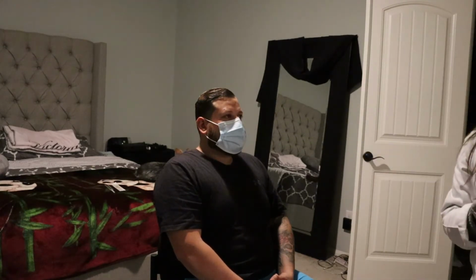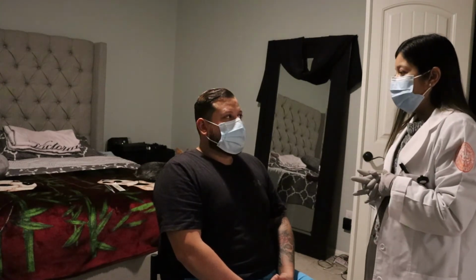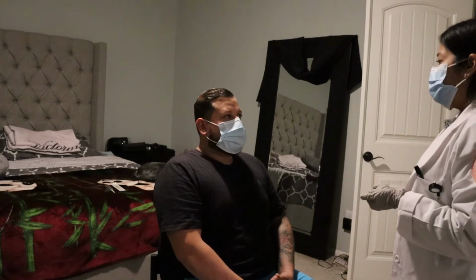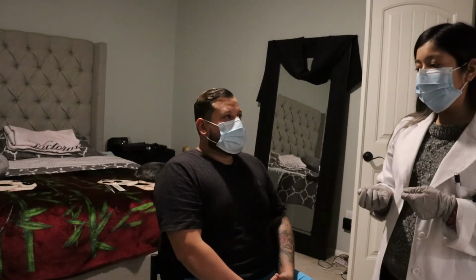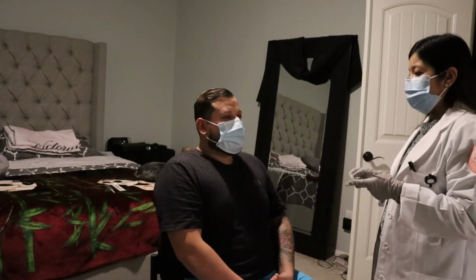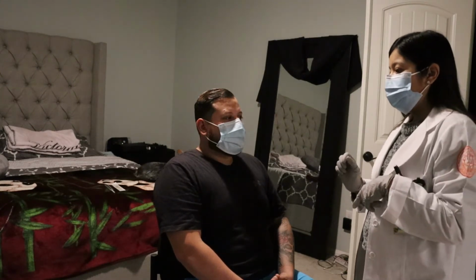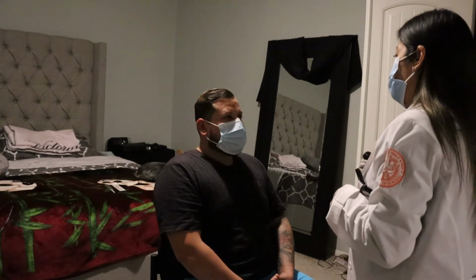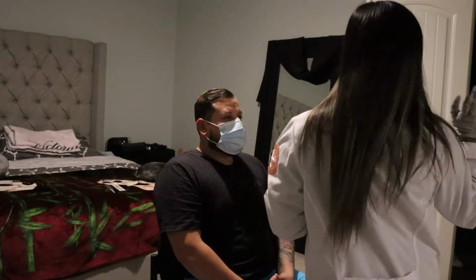And next, if I had an ophthalmoscope, I would assess the fundus of his eyes, which is the inside part of his eye. Normally, what I would do is I turn it on, put the diopter at 0, use my right hand and my right eye to assess his right eye, my left hand and my left eye to assess his left eye. And you would hold it slanted at a 20-degree angle, about 15 inches away from him. And I'd have the patient look up over my shoulder towards the wall.